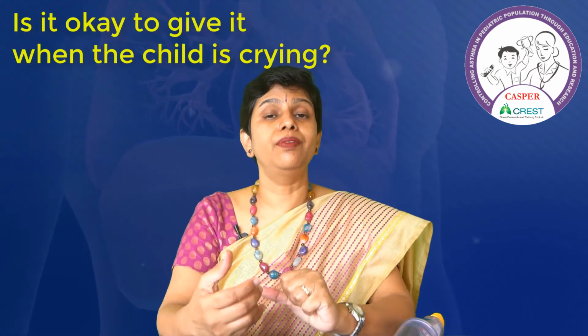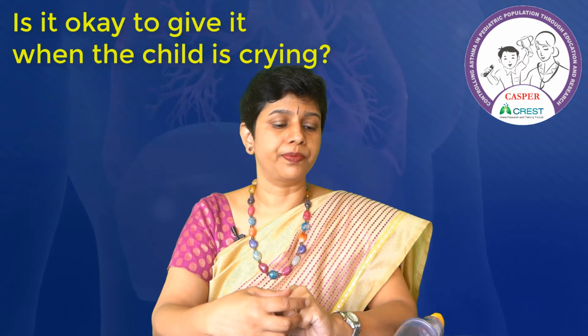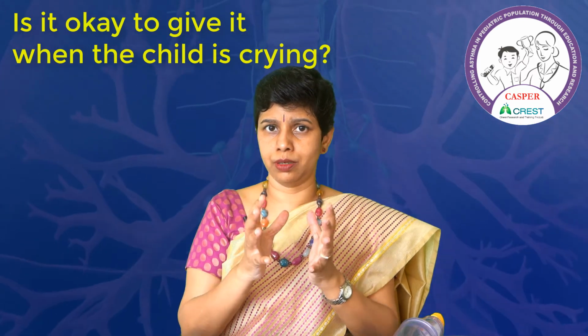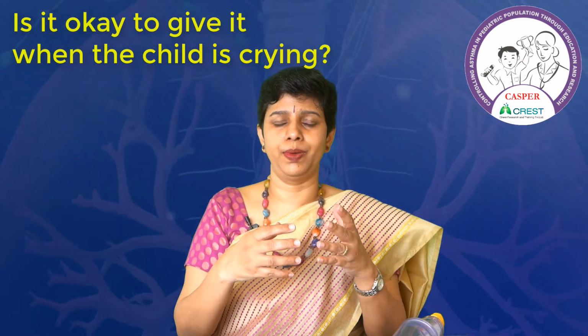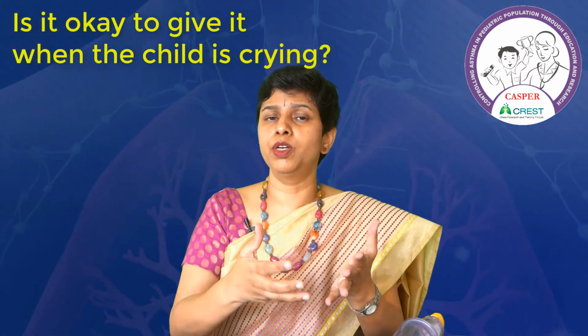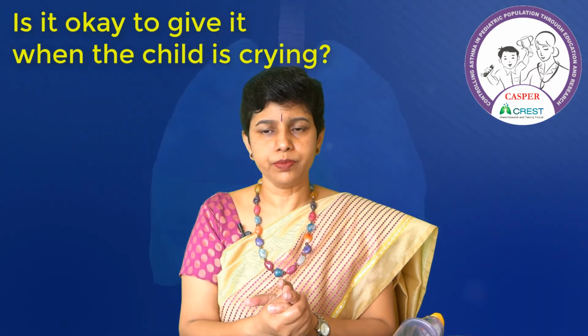Another very important question that we come across, and a clinical situation that one comes across, is can we give it when the child is crying? Well, crying is an expiratory maneuver. You can try it out. When the child cries, the maneuver is more expiratory.